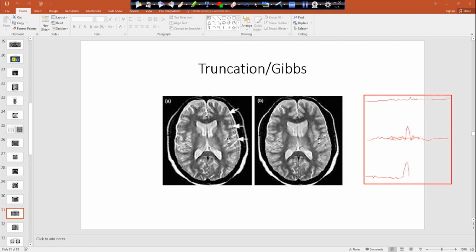Now, towards the end of K-space, we still get a high peak. So now it's basically putting that high signal in. Once again, if it's encoded in K-space wrong, it's going to be encoded in the image wrong after it's gone through the fast Fourier transformation. So now this high signal, which is supposed to be just resolution, gets streaked across our image.